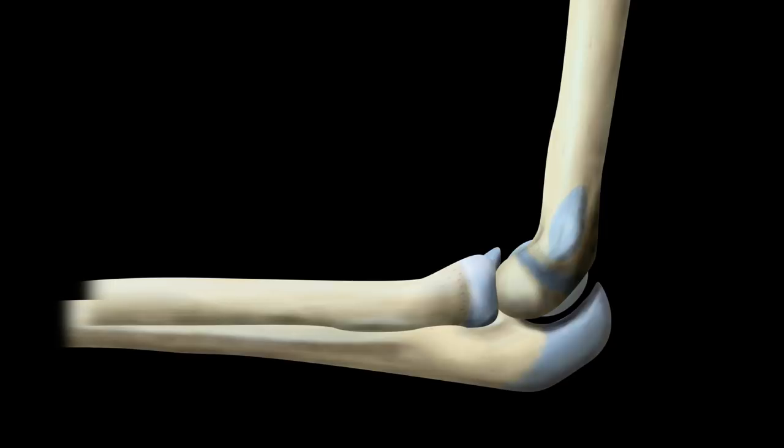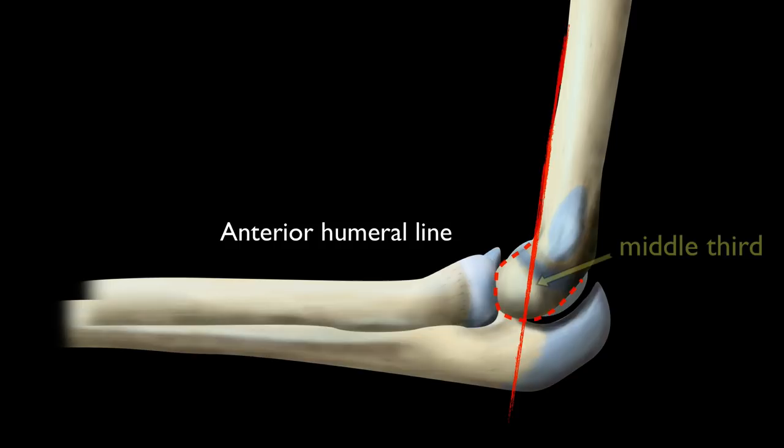A line drawn down the anterior surface of the humerus should intersect the middle third of the capitellum. Since the capitellum is displaced posteriorly in the vast majority of supracondylar fractures, this is an extremely helpful tool for demonstrating correct alignment at the elbow joint.